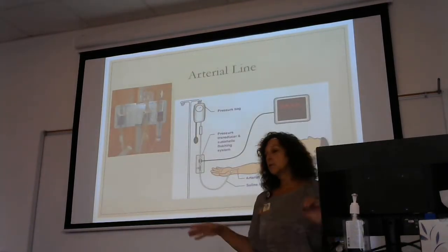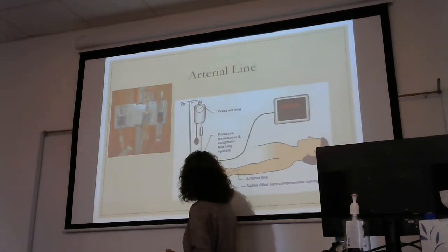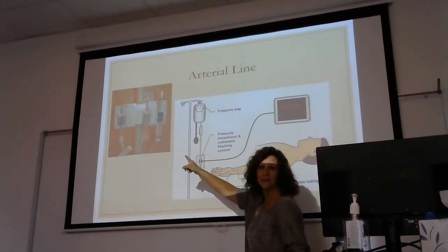The neat thing about it is it gives me a real-time pressure in a dynamic manner, meaning it's constantly there. You'll see it vary ever so slightly, and that's good. That's what I'm looking at real time. It has that characteristic dicrotic notch on the waveform again. So again, I'm looking at my waveform. Do I have that little notch? Yeah, remember that represents your valve function. Now this, guys, should be on the slide, I just want to move it, I can't. But it looks like that. That's why I put that picture there.